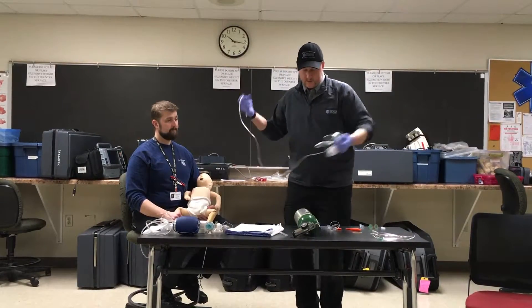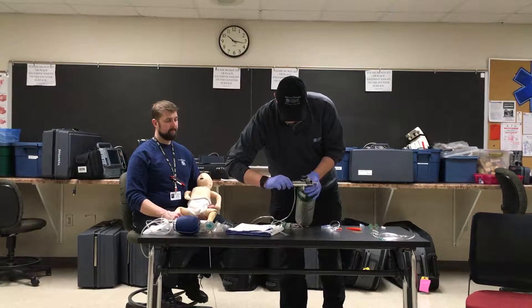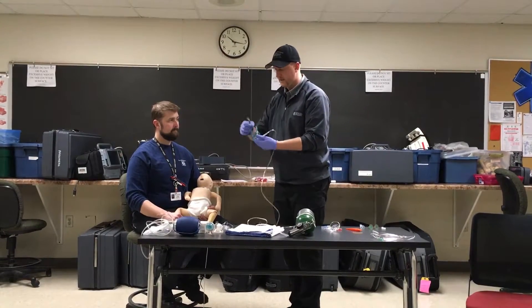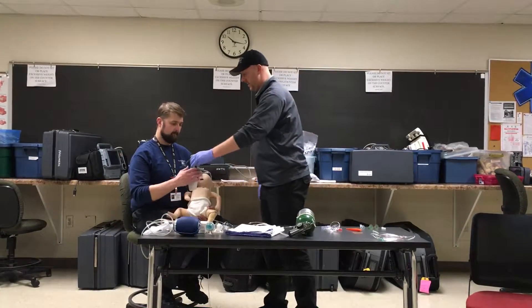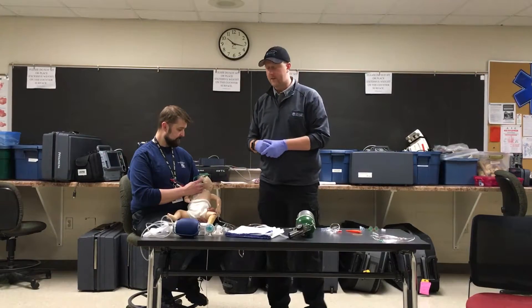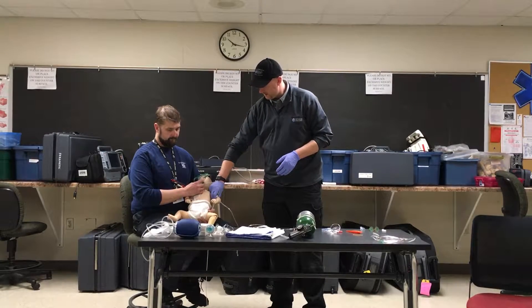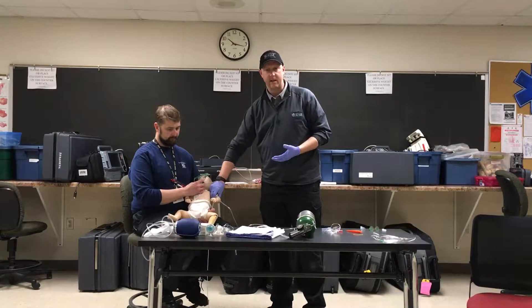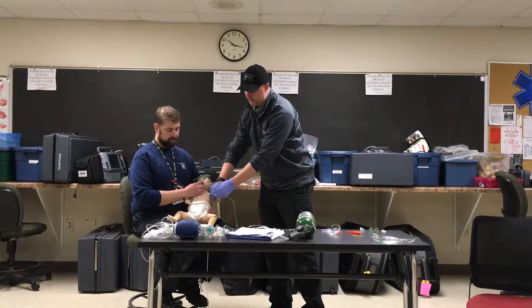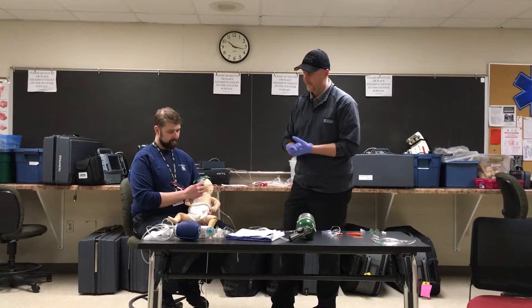Because we have that low SpO2, we're going to attach oxygen with our non-rebreather, set at between 8 and 10 liters for blow-by. I'm going to instruct the patient's father to hold it close to the airway to get some oxygen. Then I'll assess the pulse, look for perfusion, check skin color, temperature, and condition, assess cap refill, and identify the rest of the vitals — pulse, respiration, and cap refill.